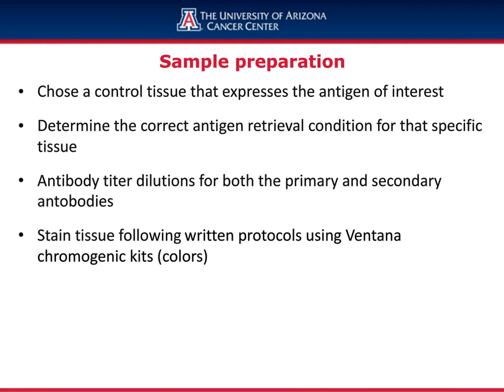Sample preparation is very important to me. I have investigators that will bring me samples that are not prepared properly. And if they're not prepared properly, as the old adage goes, garbage in, garbage out. So I have to talk with my investigators and make them aware that sample preparation is important.